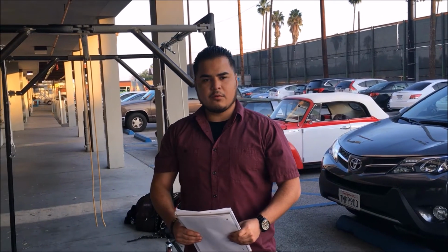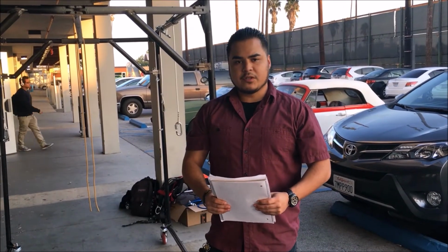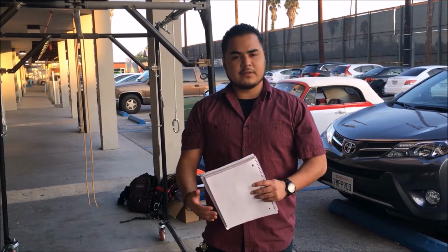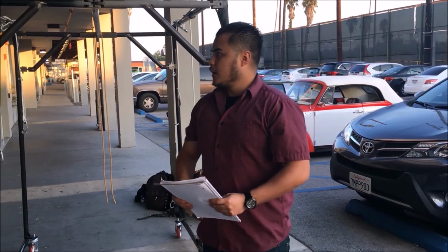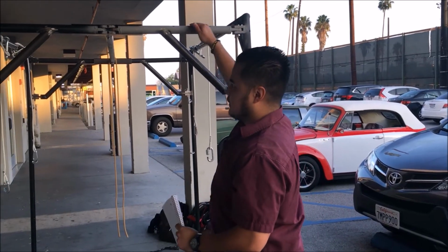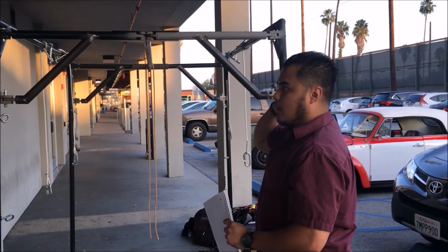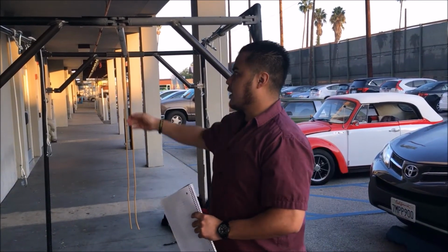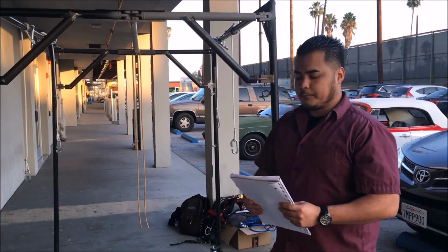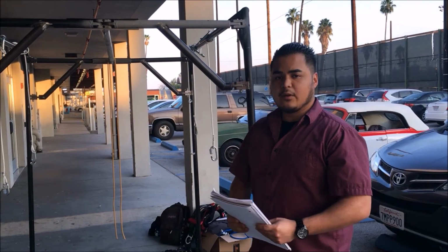To analyze the spider cage, what we had to do first was see how our free body diagram was going to be without the gussets. Originally we didn't have gussets until we added them just this quarter or semester. When we didn't have these gussets, all we had was just this free body diagram, which was acting as most of our deflection was occurring right in the middle. When we added these gussets, by the help of Dan welding them, it helped decrease the deflection that the middle bar is going to be receiving.